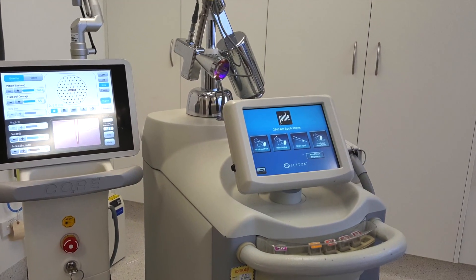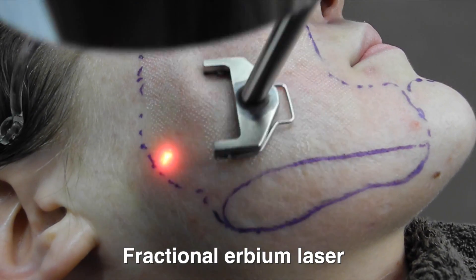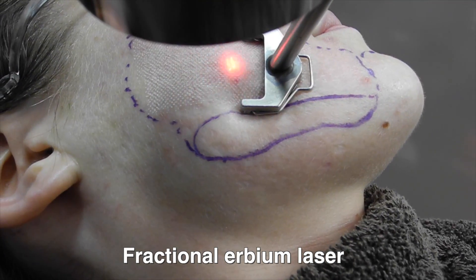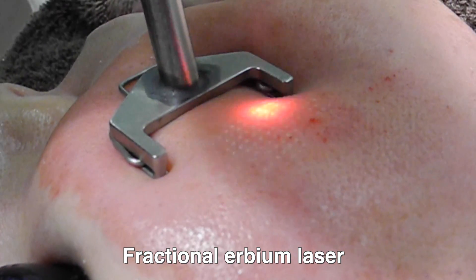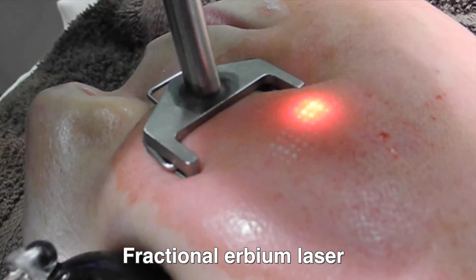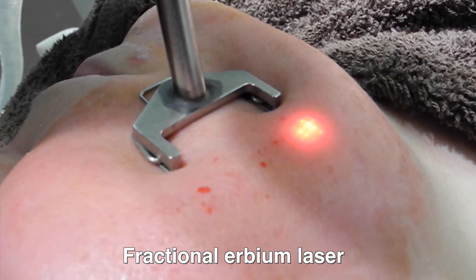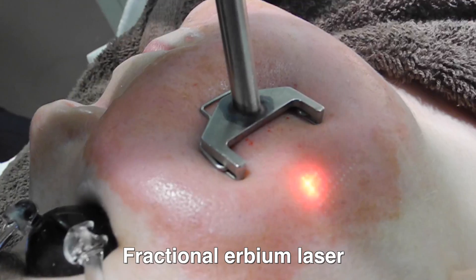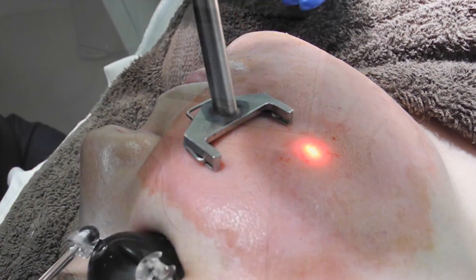Another laser which I also use is a fractionated erbium laser. An erbium laser gives less downtime compared to a CO2 laser, and it's best suited for darker skin types. Quicker recovery rates with an erbium, and often I mix this together with fully ablative lasers. You can see me doing a fractionated erbium laser — we can control the densities all the way up to 22% with this laser. Overall, a very, very good and flexible laser by Sciton, and I use this for acne scarring in darker skin types.